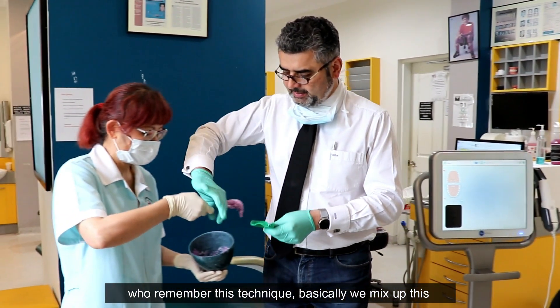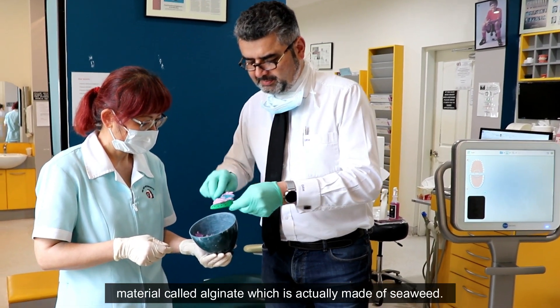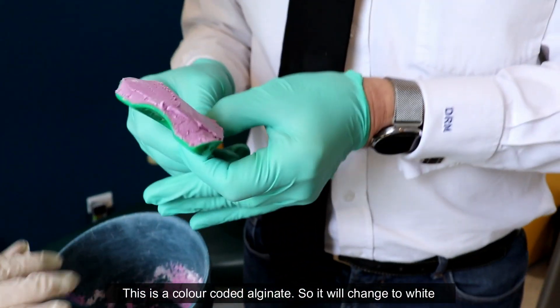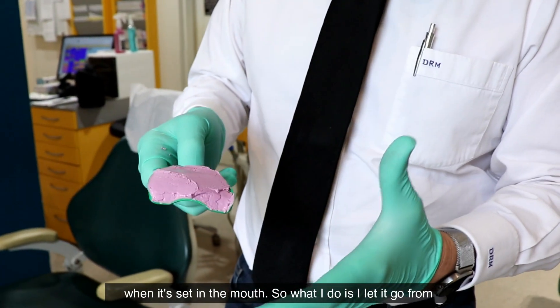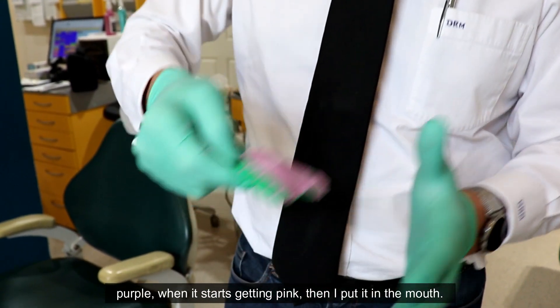For those who remember this technique, basically we mix up this material called alginate, which is actually made of seaweed. This is a color-coded alginate, so it will change to white when it's set in the mouth. We let it go from purple, and when it starts going pink, then we put it in the mouth.